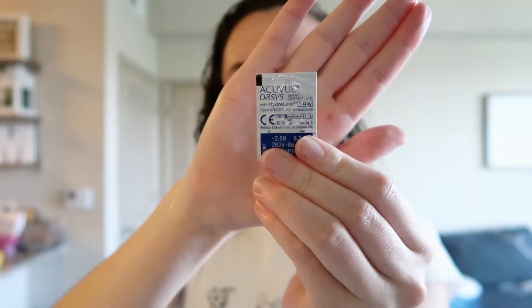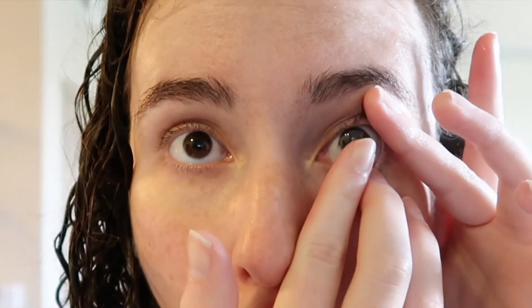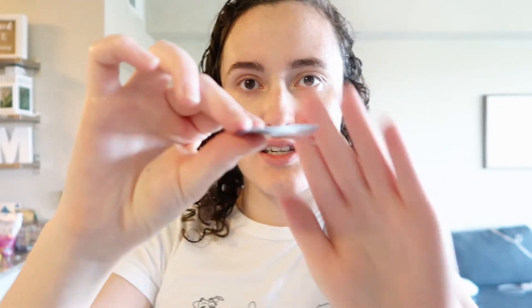My eyes get pretty dry, so I'm going to put on some lubricating eye drops just to give this contact its best shot. On my left eye I'm going to put my normal contact, which is AccuVue Oasis, and on my right eye I'm going to put the Scout lenses from Warby Parker. I put both in. One thing I want to say is that the Scout lenses are a lot less plastic — so this is a lot less plastic than my AccuVue Oasis.